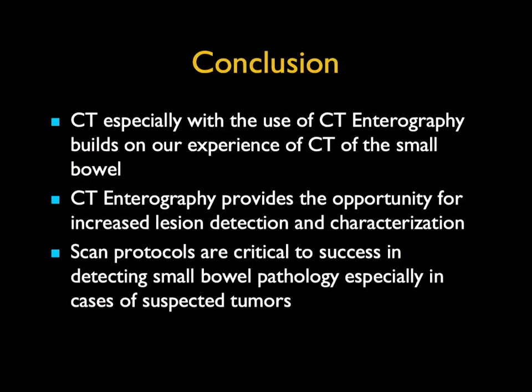So we've gone through a number of different things. We've spoken about the importance of technique, both in terms of bowel opacification with positive or neutral agents, as well as the importance of using multiplanar and 3D imaging. We talked about the opportunity we now have for picking up tumors that were missed in the past, that often were symptomatic in the patients, or that we picked up too late, so we can do better there.